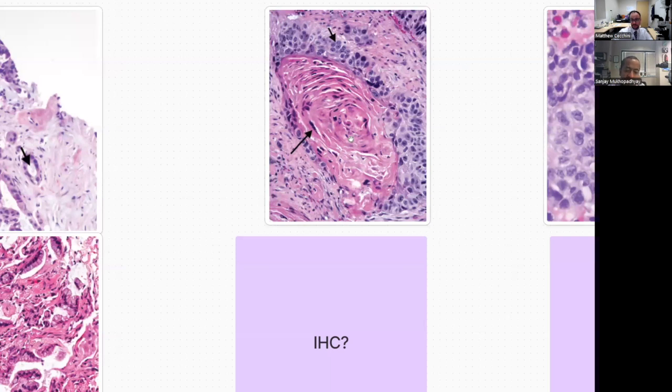And as usual, Dr. Katzenstein was far ahead looking at this problem. She realized many years back. Actually, the first author on that paper is my wife, Erica Dockstader. So she did this paper with Dr. Katzenstein where they looked at exactly this question: can lung carcinomas be P16 positive? And in that paper, from what I remember, almost a third of lung cancers were P16 positive, but none of them were high risk HPV positive. So if you use P16 and say whenever P16 is positive, I'll call it a met from somewhere else, you will go wrong because lung cancers can be P16 positive, that's primary lung squamous.